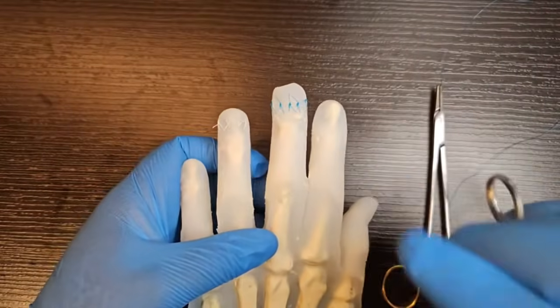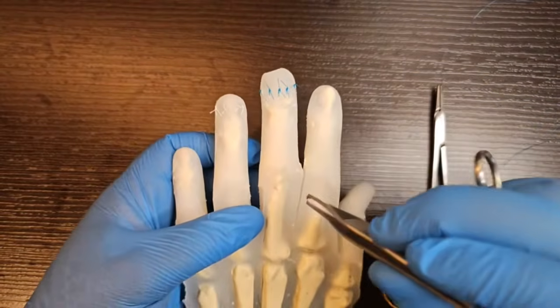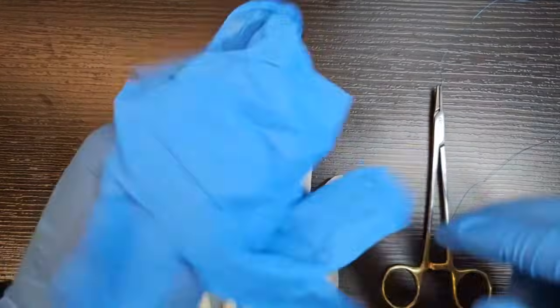So that's how I do the ring block. Now for these cases, they do bleed a reasonable amount, especially if there's a fracture. So you also want to use a finger tourniquet. If you haven't got a finger tourniquet, you can make a finger tourniquet. How do we do that? You get a sterile glove.